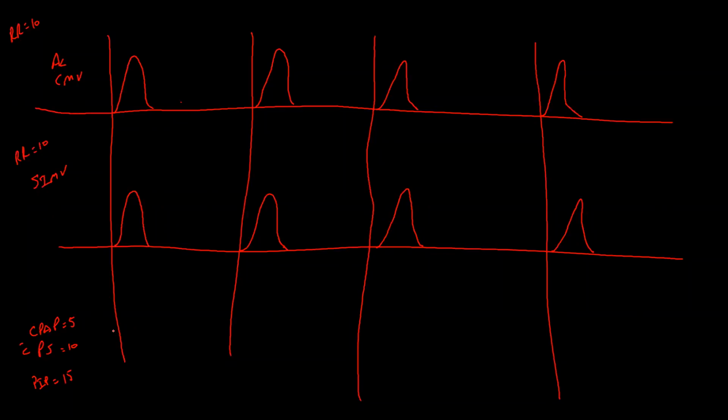So the difference comes when we breathe extra in the window. If we start overbreathing the ventilator, every time you overbreathe the ventilator, you're going to see that negative deflection. First of all, that shows you that the patient took a breath and that decreased the pressure for a split second.